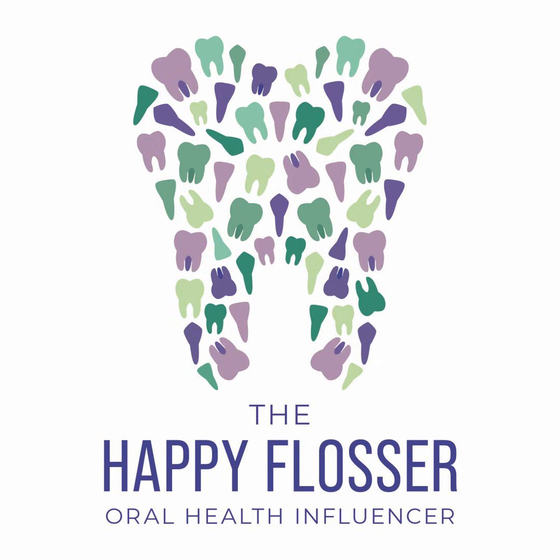Oh, and you can see calculus on a radiograph. That's probably one of our fun things that we look for, if we can see that calculus instead of always just having to find and feel the calculus. And I know as a student, for you guys, sometimes when you're able to see the calculus on the radiograph, it gives you that confidence to then go in and find and feel it and say, "Oh yes, I can definitely feel that calculus."